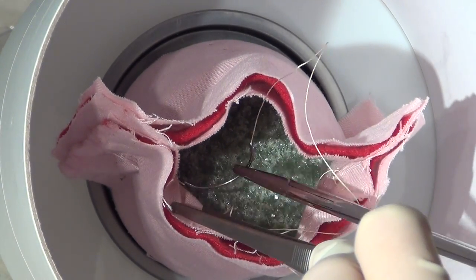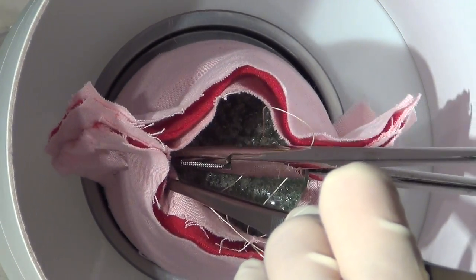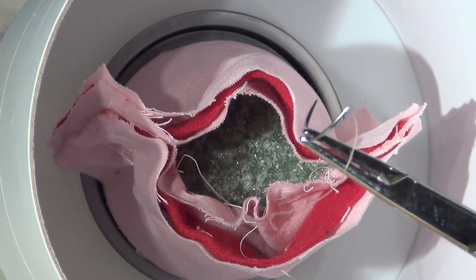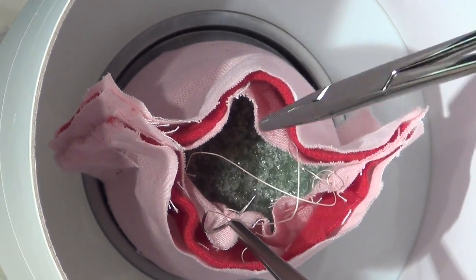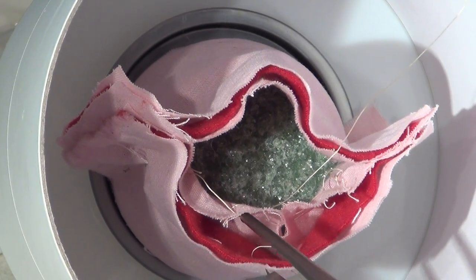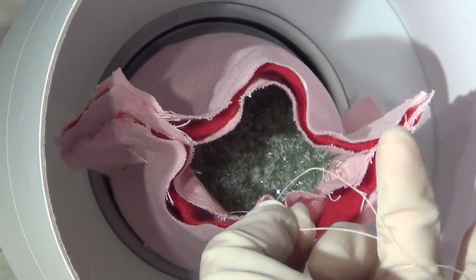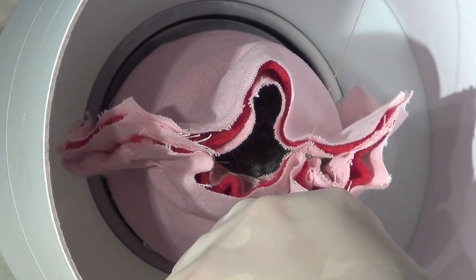Here a stitch is placed through the cut end of the right uterosacral ligament. Once this is removed, a final skimming bite will be taken through the peritoneum of the rectum back towards the midline, and one final stitch will be placed all the way through the peritoneum to the vaginal epithelium back in the midline. After the vaginal cuff is closed, this stitch is tied down and all of these tissues will be brought together in the midline, obliterating the cul-de-sac.